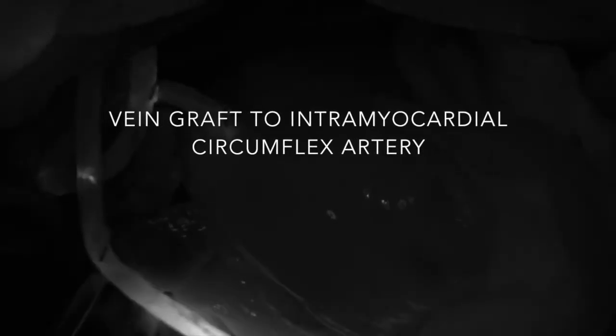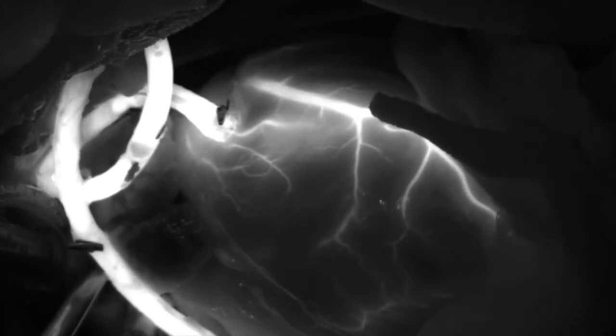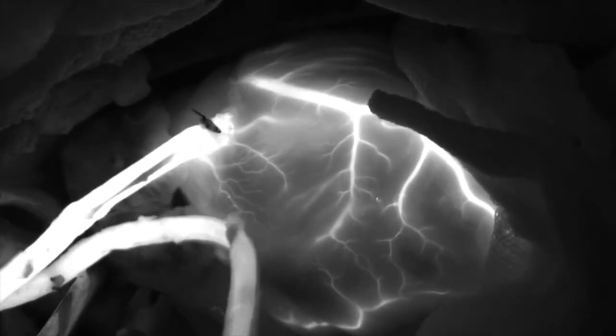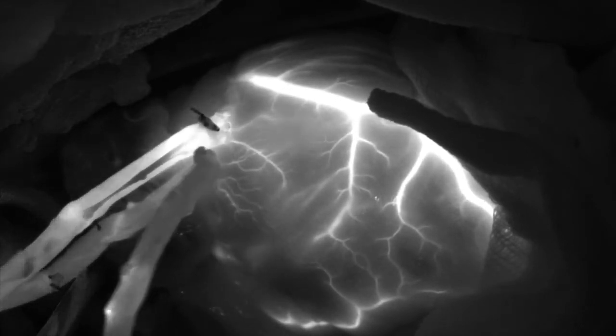Our first coronary bypass graft performed is to an intramyocardial circumflex coronary artery. We inject 10 cc's of a dilute Indocyanine Green solution followed by a chase of 10 cc's of heparinized blood. We look for three different phases of blood supply to the heart, including the arterial phase, the myocardial blush, and then the venous phase. The circumflex coronary artery is poorly visualized in this demonstration because of the poor penetration of the laser used to excite the ICG, which travels only one millimeter.